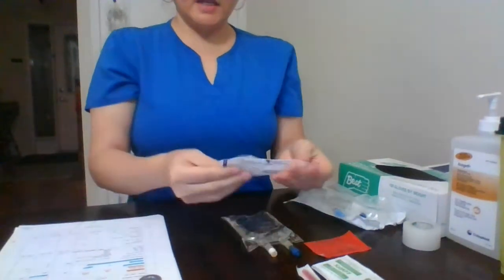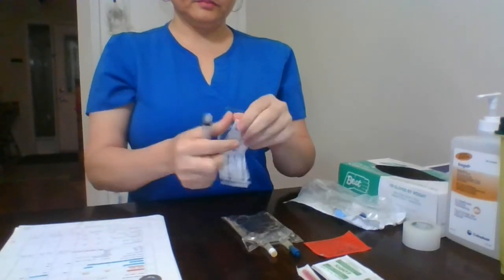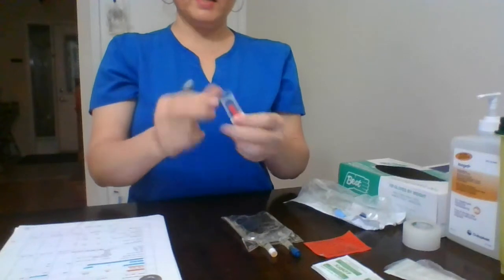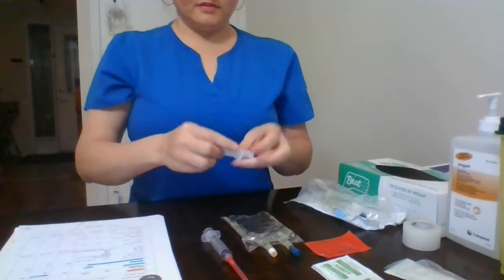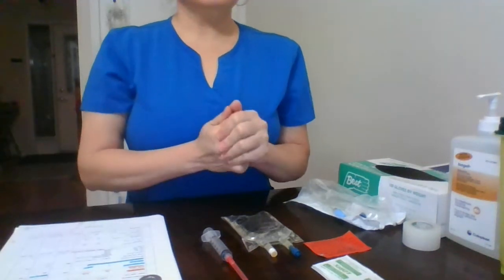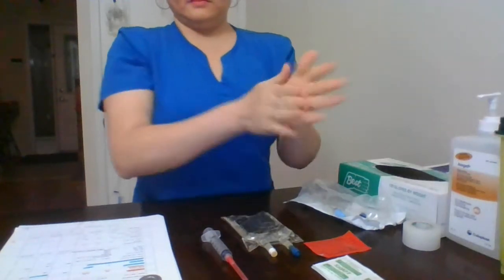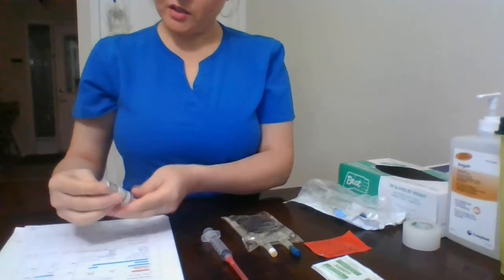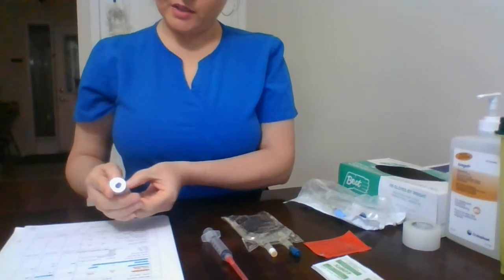So I will take my syringe. I have a 5 ml syringe, and I have my needle, 18 gauge. Once again, I will compare my medication with my MAR, which is 40 milligram of pantoprazole every 6 hours.